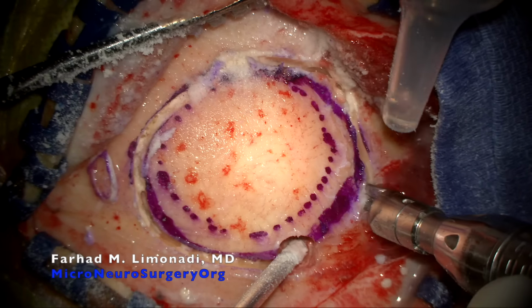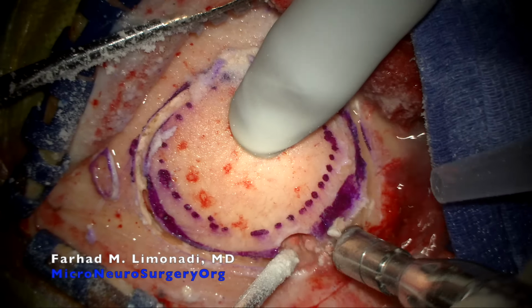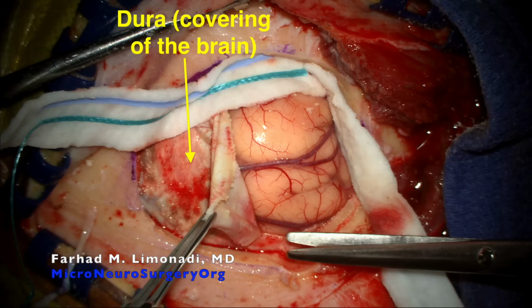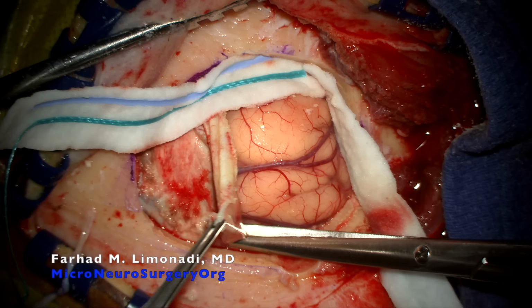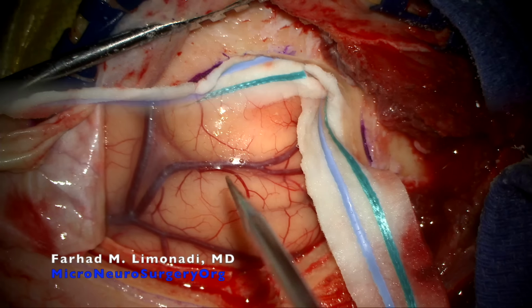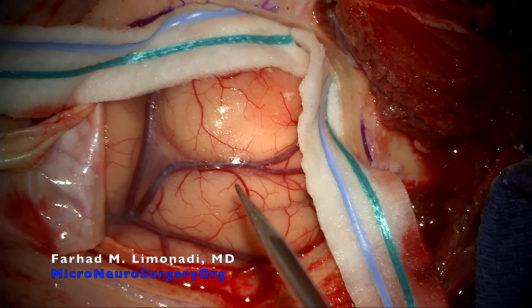Bone flap is elevated using a side cutting drill. Dura is opened sharply. Computer navigation is used to confirm the precise location of the tumor.